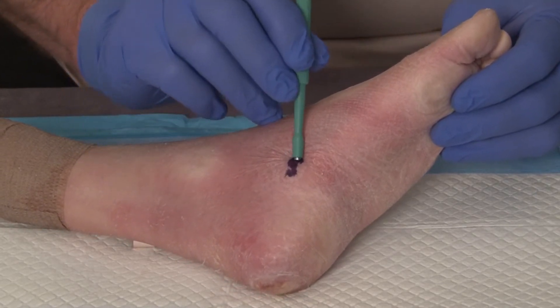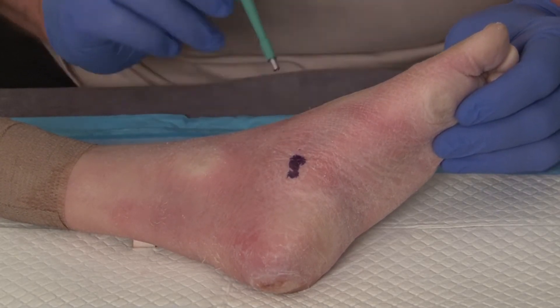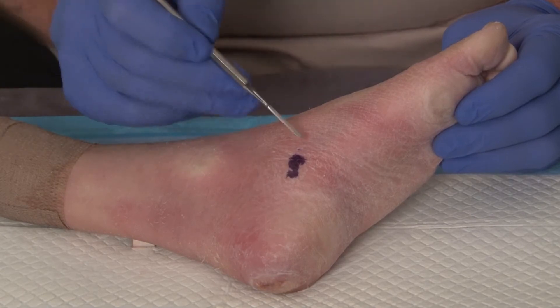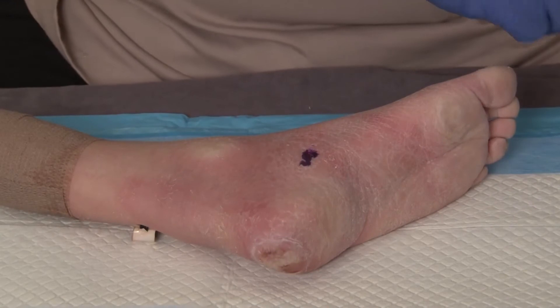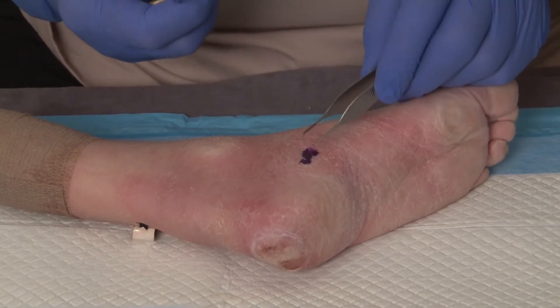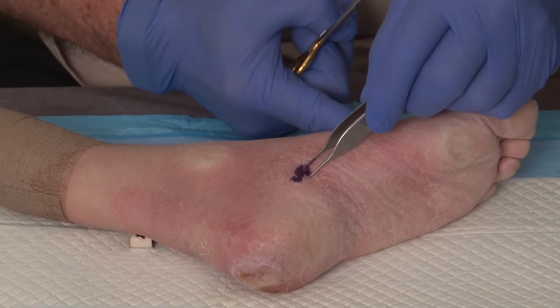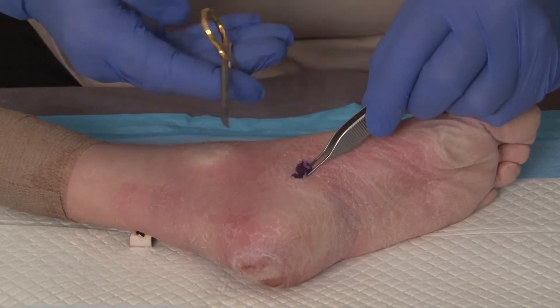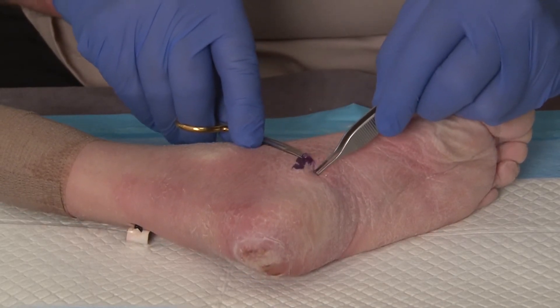Then we can simply elevate this back up and you'll see there's our punch biopsy specimen right here. Now we can take that out by very gently lifting the tissue up, trying not to grab it, and then cutting the deep subcutaneous tissue and lifting the specimen out.